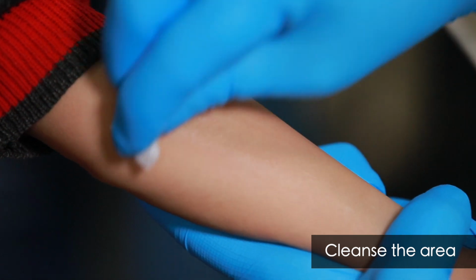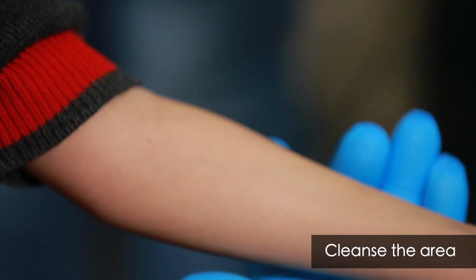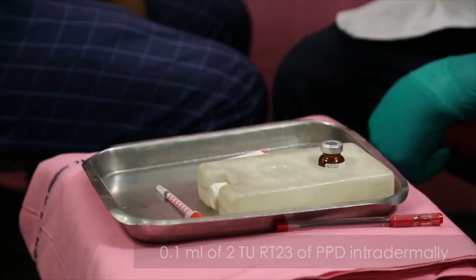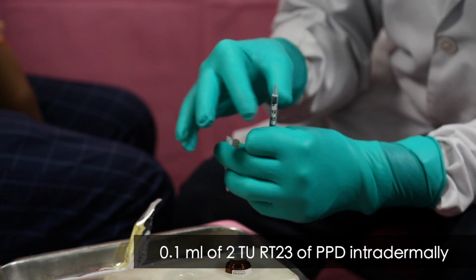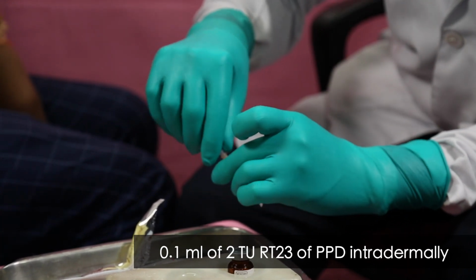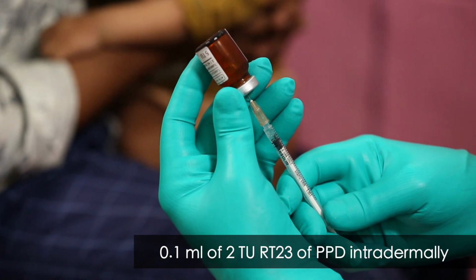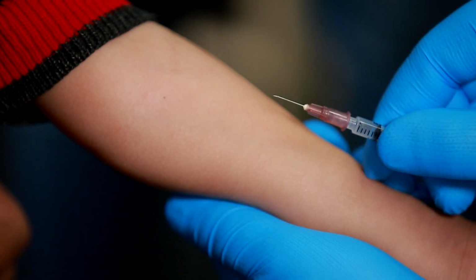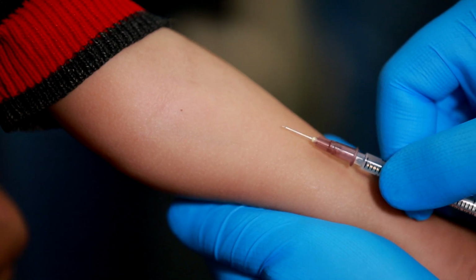This is to be given on the volar surface of the forearm. Cleanse the area with an alcohol swab. Allow the area to dry. TST is administered by injecting 0.1 ml of 2-TU RT23 of PPD solution intradermally. If 2-TU is not available, no more than 5-TU should be used.